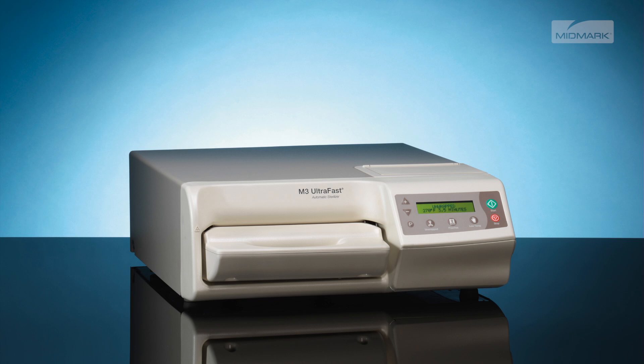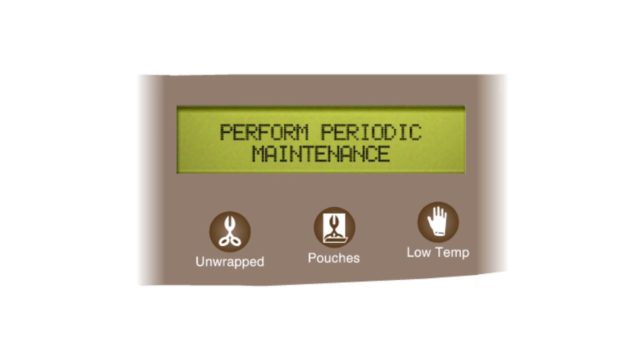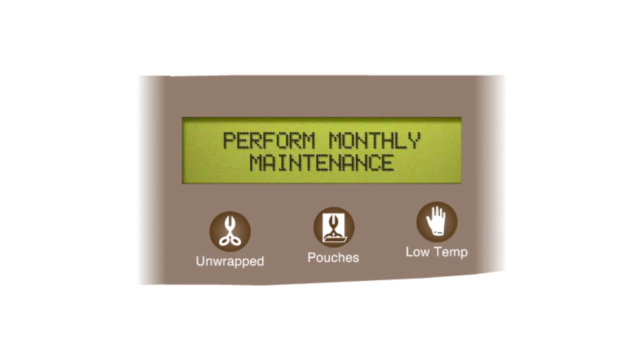To help ensure correct operation and maximum sterilizer life, the M3 is designed to provide the operator with reminders when it's time to perform operator maintenance. After the M3 is powered on for 7, 14, and 21 days, a message stating 'Perform Periodic Maintenance' will be displayed. After 28 days, a 'Perform Monthly Maintenance' message will be displayed.